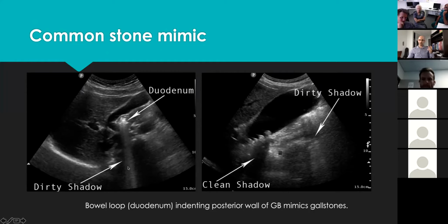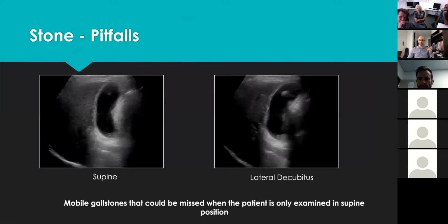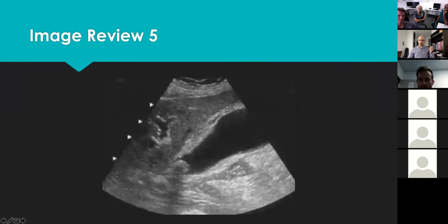Yeah, I can see that. And I think that those dirty shadows look exactly like B-lines on lung ultrasound. Yeah, and now back to this example that we just had. I see what you mean by this shadow still having a little bit of echogenicity in it, but do you agree that it's still hypoechoic in comparison to the surrounding area? Yes. Okay. It can be a bit hard to differentiate between them sometimes.